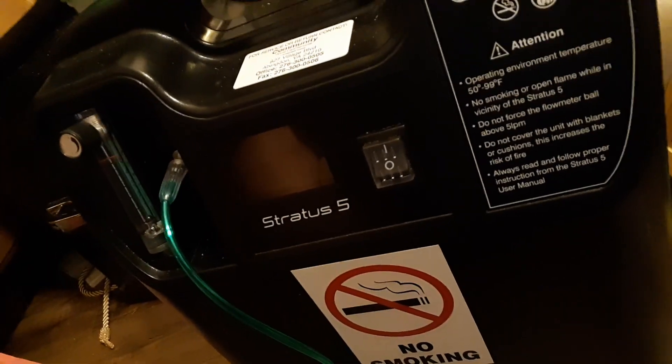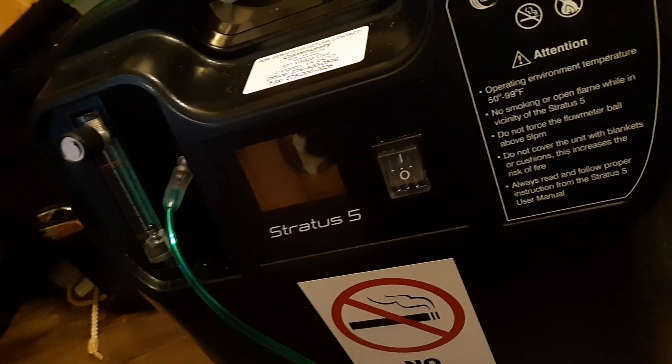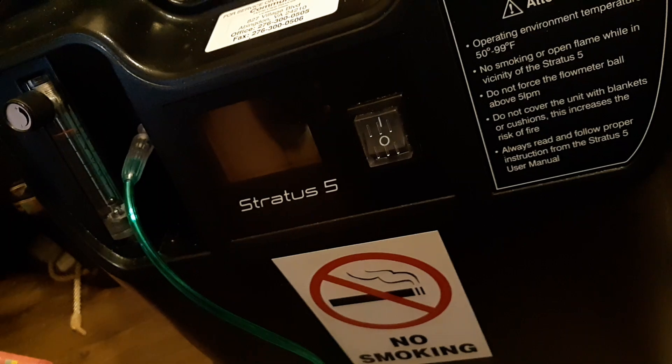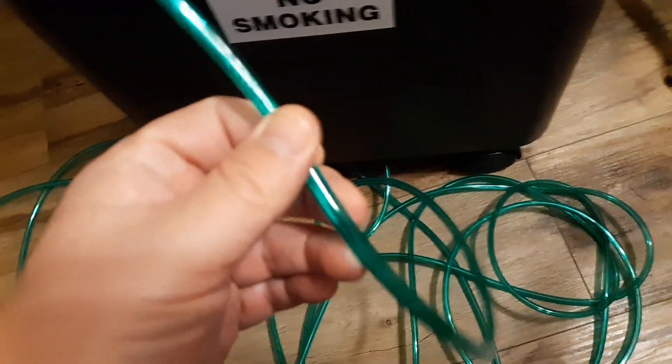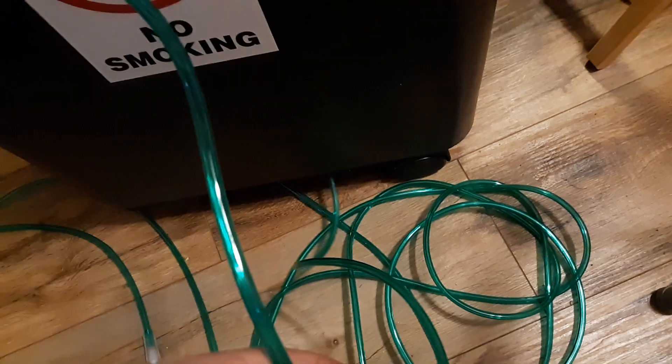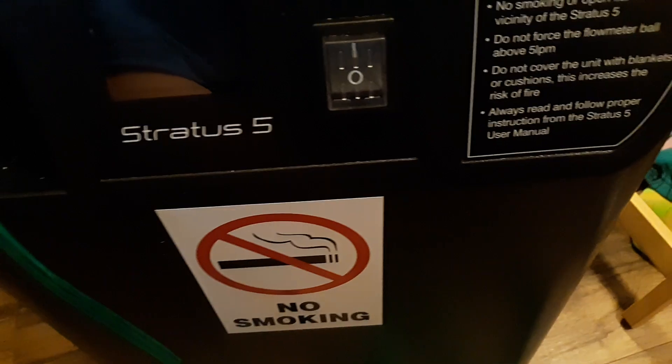Turn it back on and see if the red low light goes off. If it does not, check your oxygen line — your tubing. This one is really long so the patient can travel to the bathroom and kitchen. Check the line thoroughly and make sure there's no kink all the way through it.